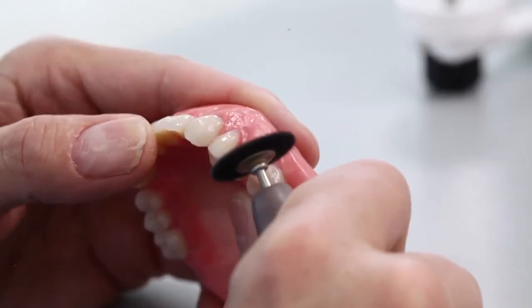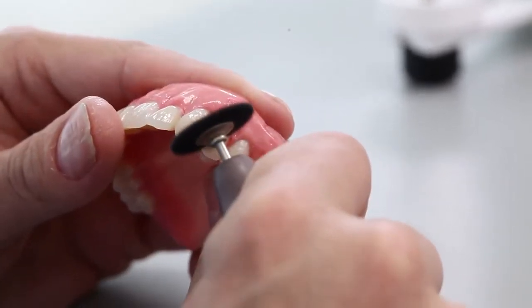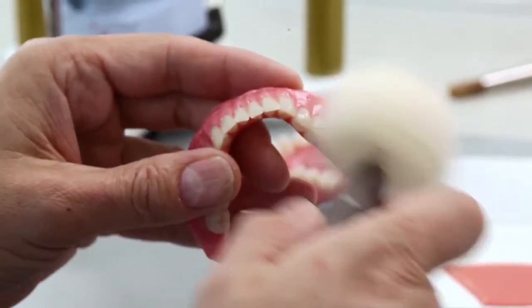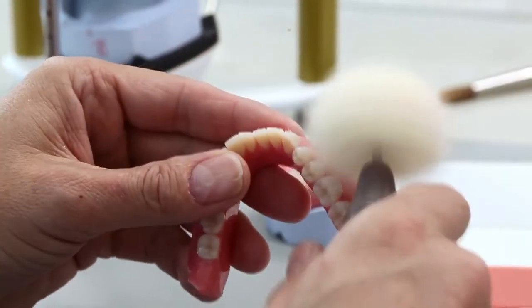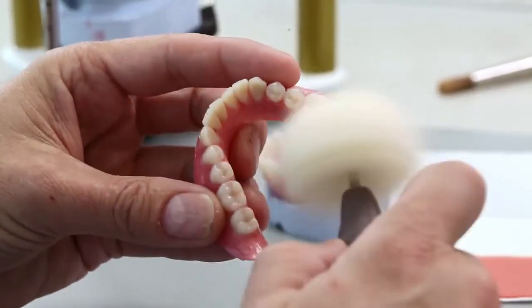Our tip: use a synthetic hairbrush to remove wax residue from the teeth. Polish the wax to a high gloss using a foam polishing pad. A polished surface is pleasant for the patient and simplifies the completion of the denture later on.